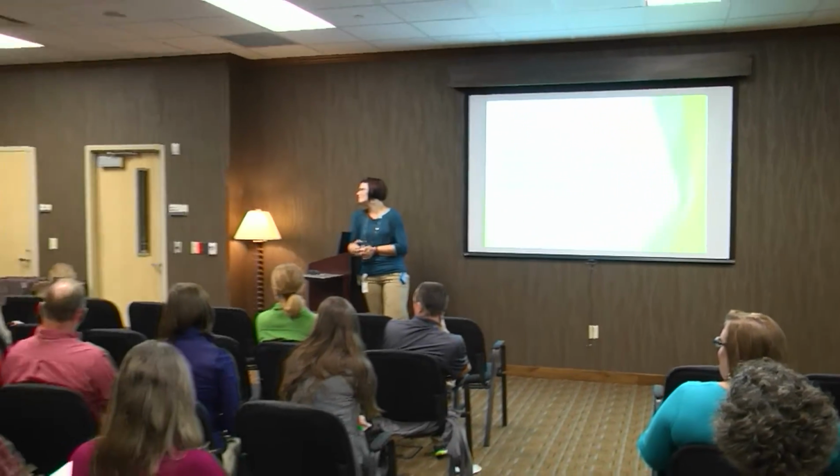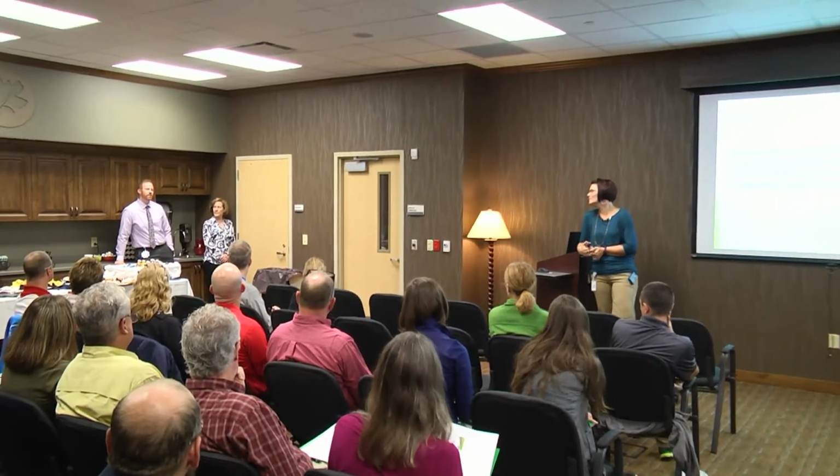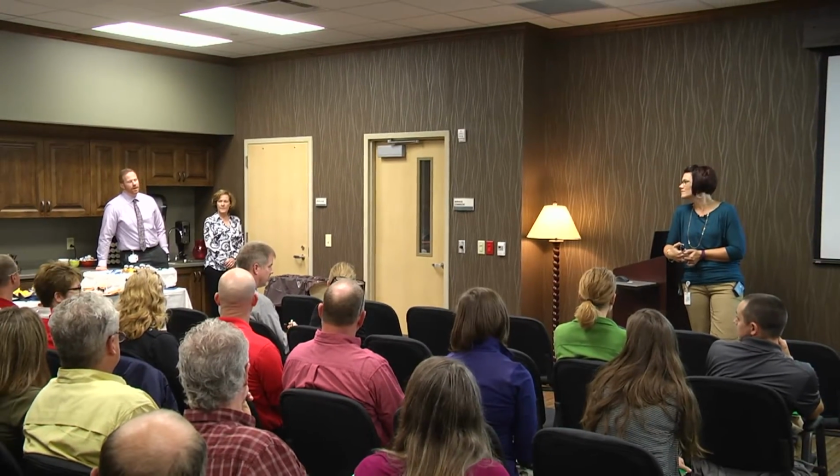Dr. Kerr, are you sending patients home with a CPM with a partial? I do not, no. If a patient requested it, I'd be willing to, but as a whole I'm not a huge proponent of CPMs, and for partials we're routinely not doing them. For totals, do you use them? That's been a debate. I don't, but some of my patients are requesting them, and the standard practice in this area is that a lot of patients are having CPMs and other surgeons are using them.